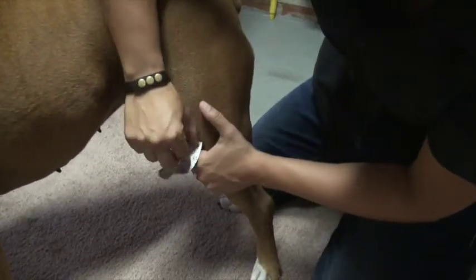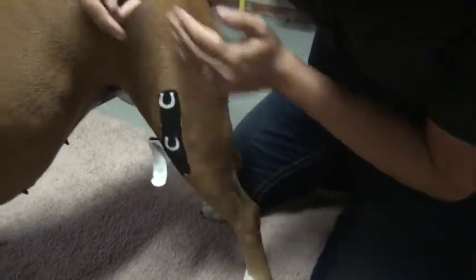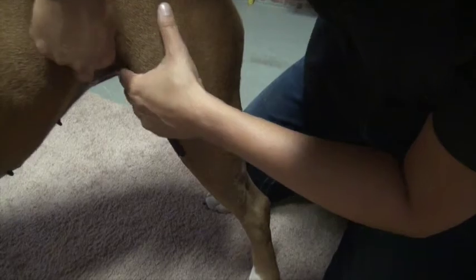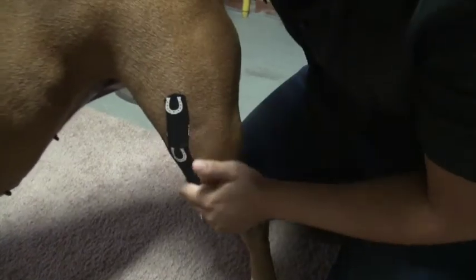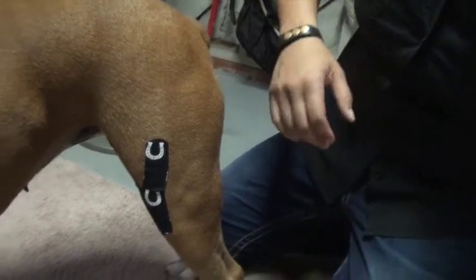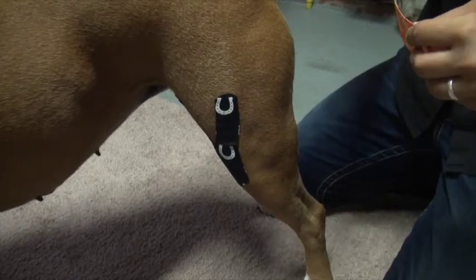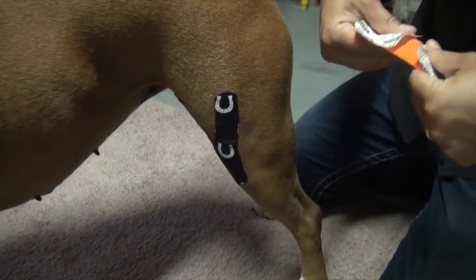And then we're going to take these two Ys, and we're just going to kind of hug it going up along the leg like that. And we're going to do one on the inside. So that's going to be our first piece that we lay down. You can actually do this either way. You can either lay the stabilization first and then put the Y, or you can do it this way and then do the I strip as the stabilization on top of it. So that's what I'm going to do right now.